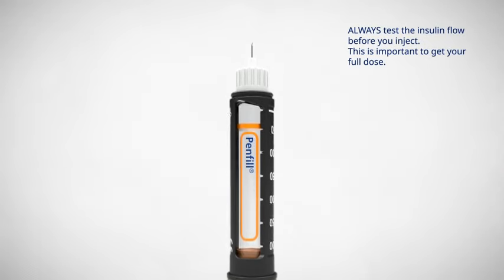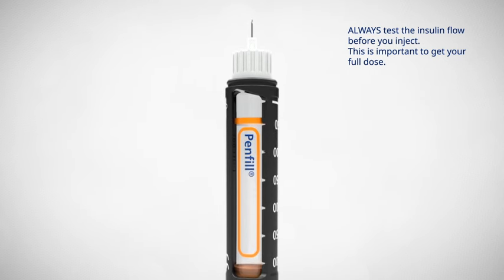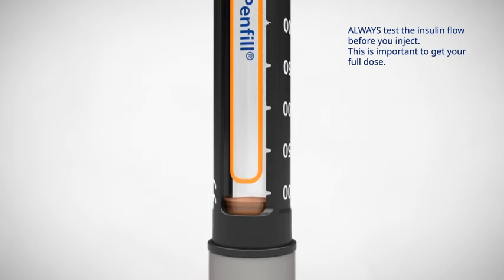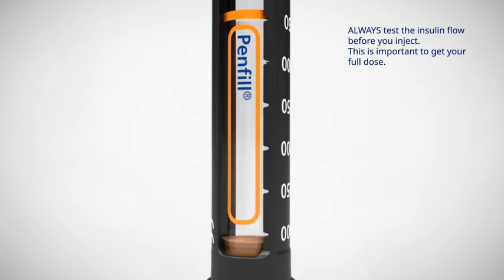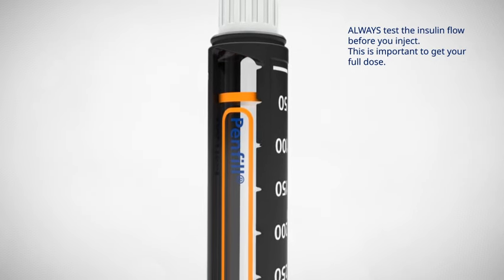Always test the insulin flow before you inject. This makes sure that any gap and air bubbles are removed and that insulin is getting through the needle. If you do not test the insulin flow, you may get too little insulin or no insulin at all.